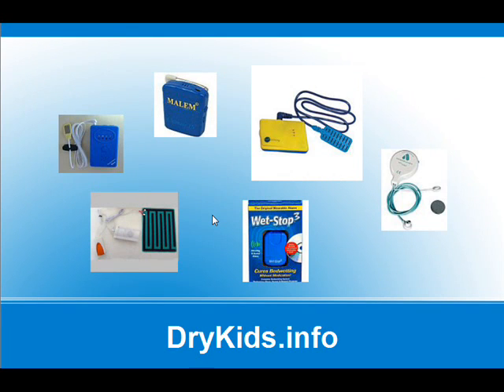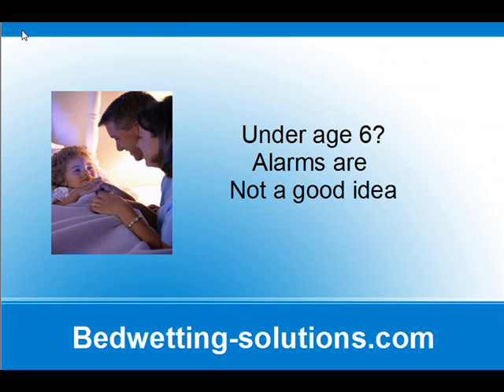You'll find them on eBay, all over the internet, and sometimes in drugstores. You should know there's a big difference between the various models. And before we go further, you should know, if your child is under 6 years old, you should not use a bedwetting alarm at all. There are better ways to help them get dry.